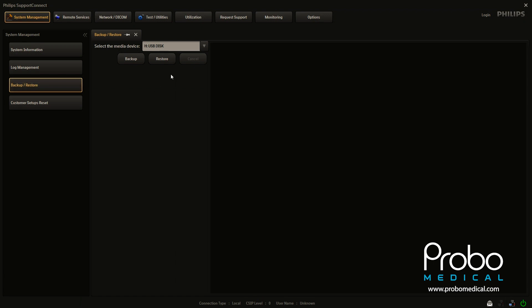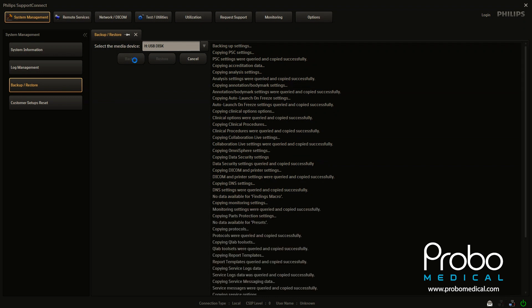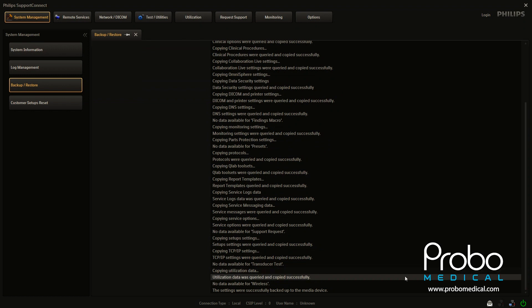You can see here that the system has already selected the USB disk for us, and we're just now going to click on backup. The system is now in the process of going out and finding all the individual files it needs to find, it is backing them up to the flash drive, and if you scroll all the way over here and scroll down to the bottom, it will actually tell you the settings were successfully backed up to the media device.